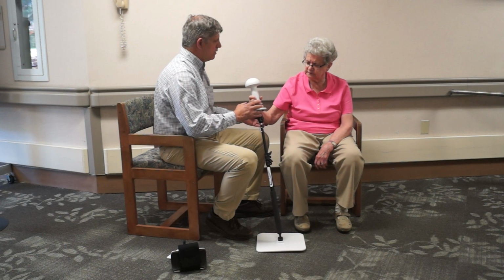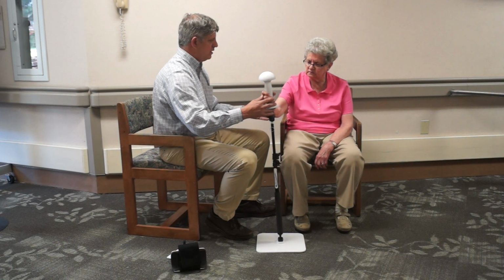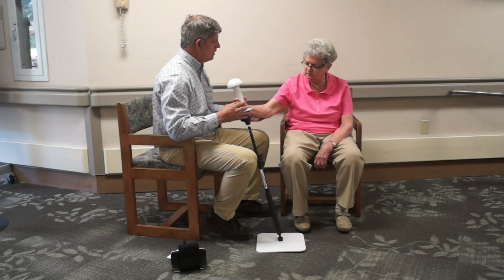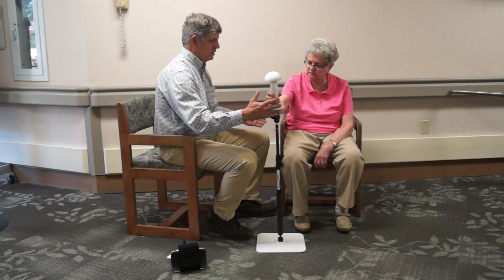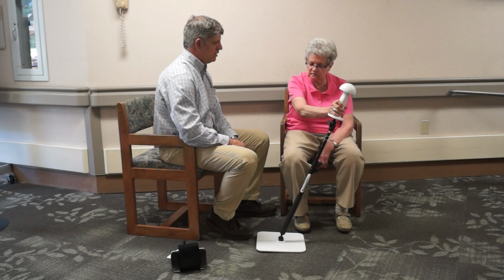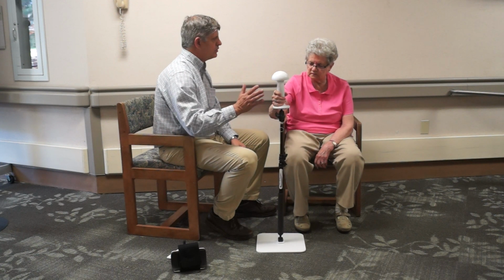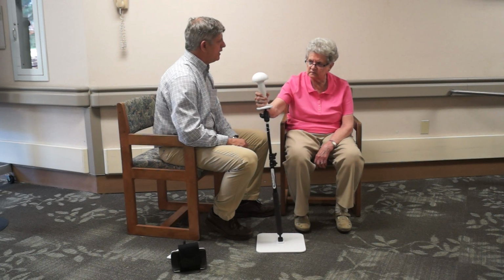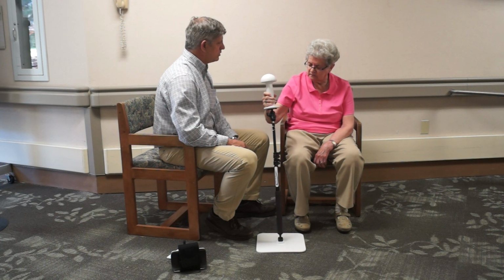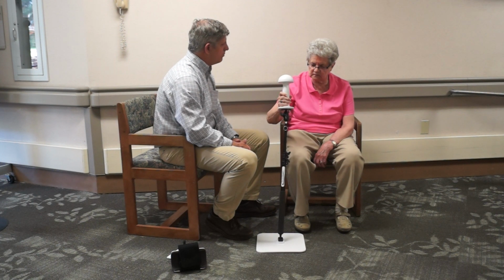Okay, now I want to ask you just to kind of explore movement, like you're going to set the object over here and just go in different directions, like you could come out towards me. Good, just keep exploring. Now I'm going to let go and let you do that on your own. There, good job. And just kind of look at your targets. Try to make it meaningful, like you're executing at home, all right?